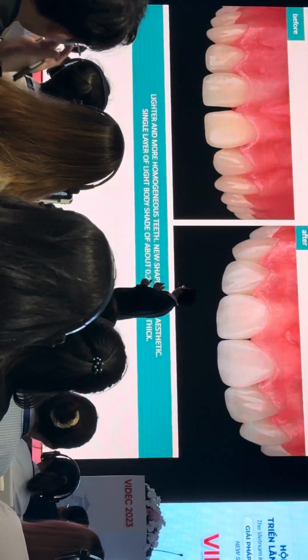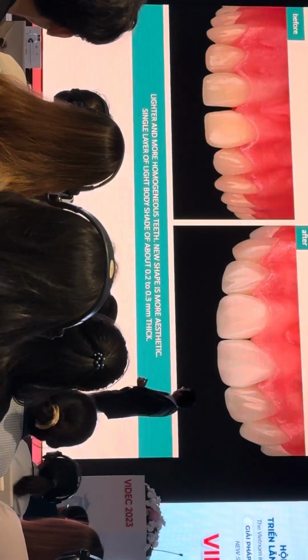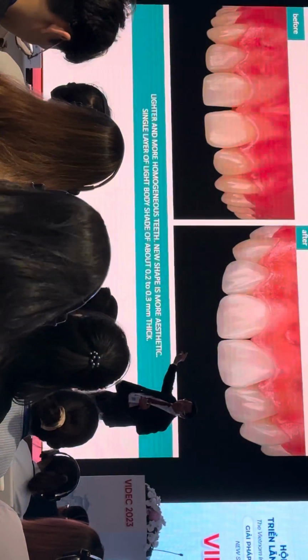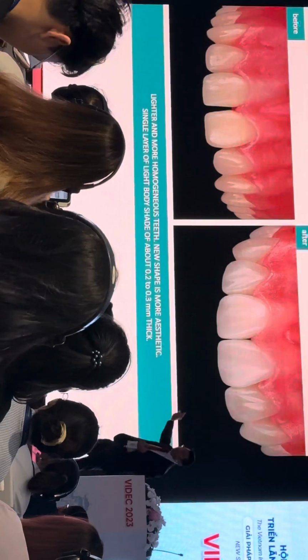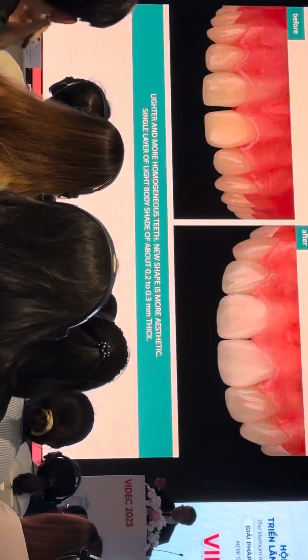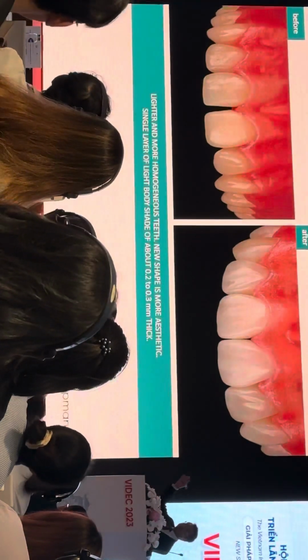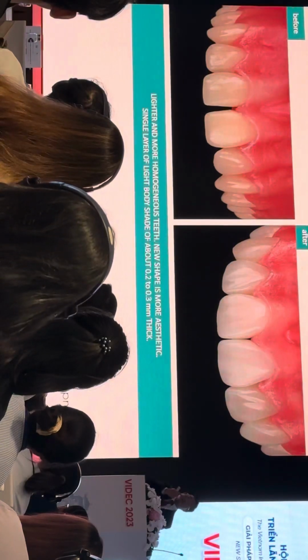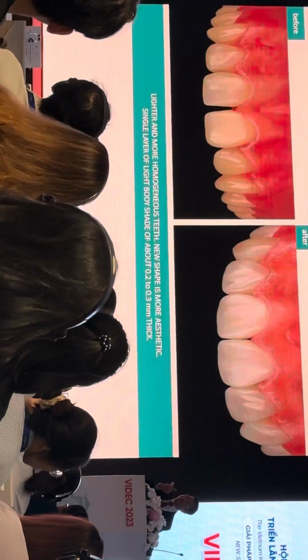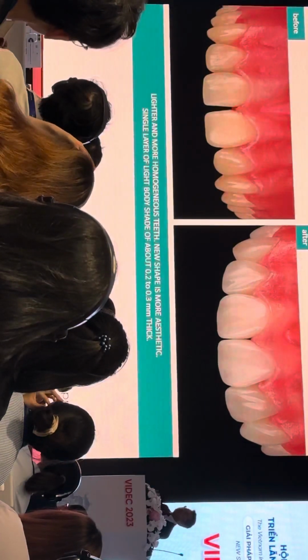So bleach, and then just this was placed with the A2 shade and looks very nice. Simple way and high aesthetic. You don't need to grind the teeth, no need. Because when the patient gets old, you still have your natural tooth in the mouth. Okay? That is a big advantage for the minimally invasive concept.